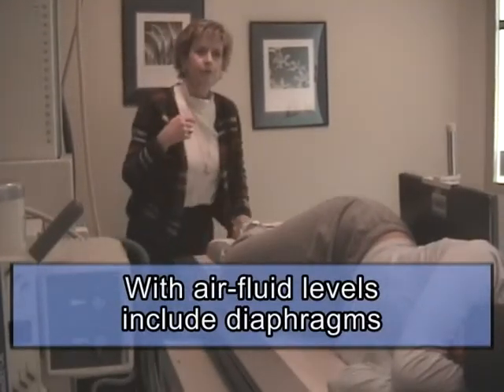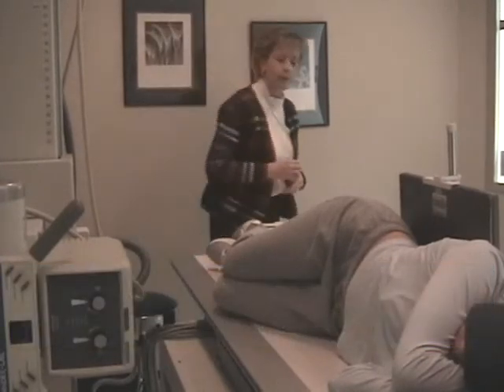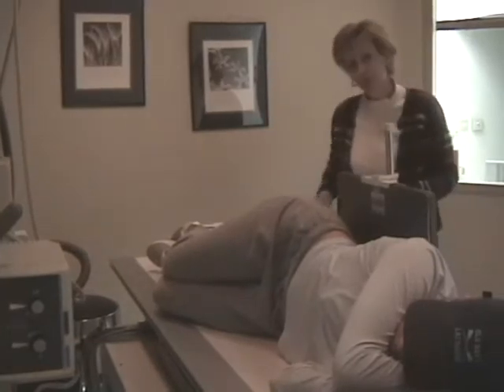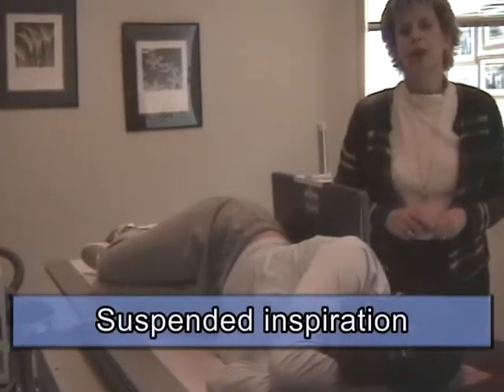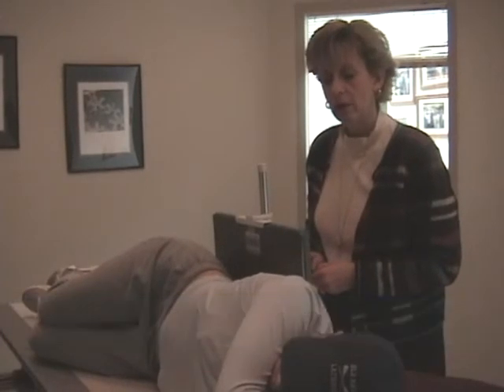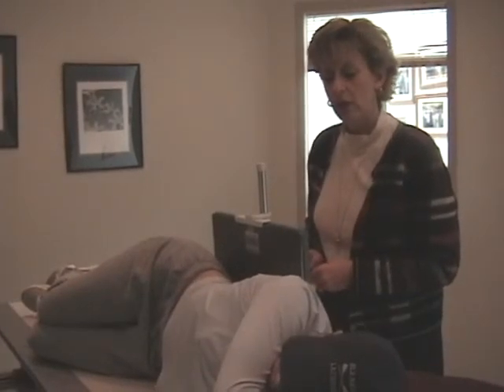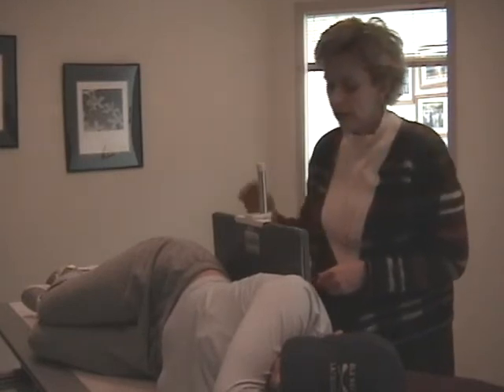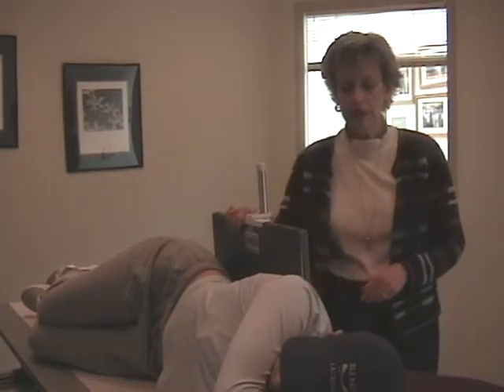How do you help to ensure that diaphragms are included? It's a breathing technique. What do you think that might be? Suspended inspiration. Have your patient take in a deep breath, blow it out. Take in another deep breath, and hold this one in, please. There you go. Last thing we're going to talk about is technical factor adjustments.